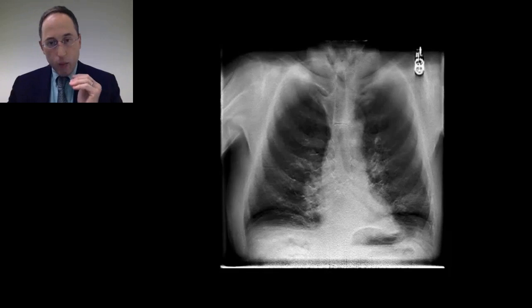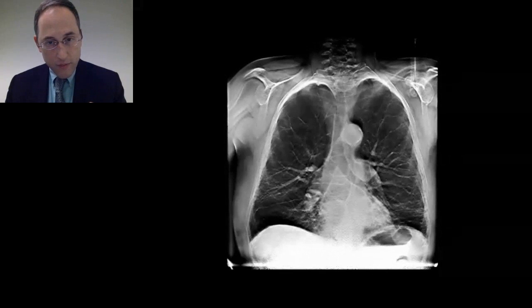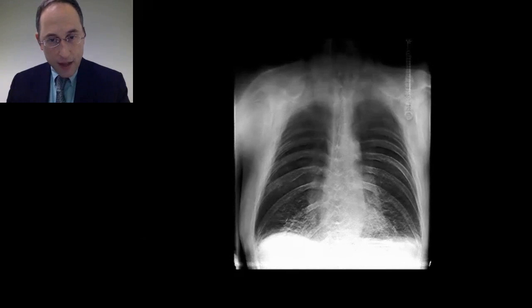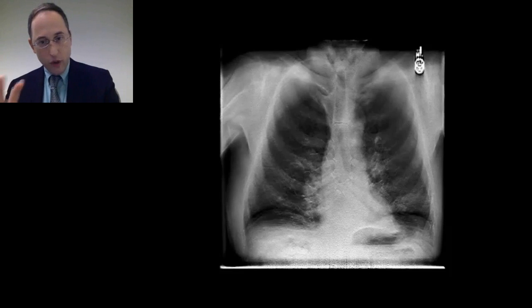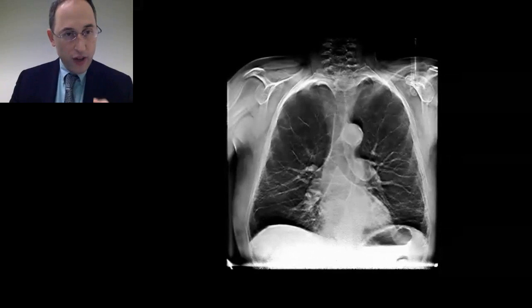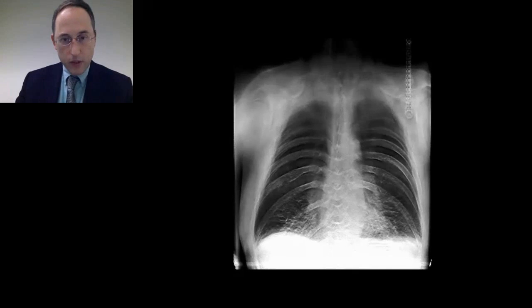Okay, so again, we're scrolling through the patient. Notice how you have ribs and the anterior ribs in focus. Then they disappear. Then you see the airways. Vessels come in and out of plane as you go to the back, and then all of a sudden you see the spine. So there definitely is this concept of slices where you don't have the anatomy in front of and behind, and the in-plane resolution is very, very high, which is difficult to appreciate through a medium like this.